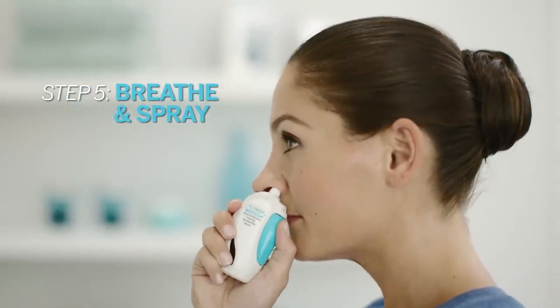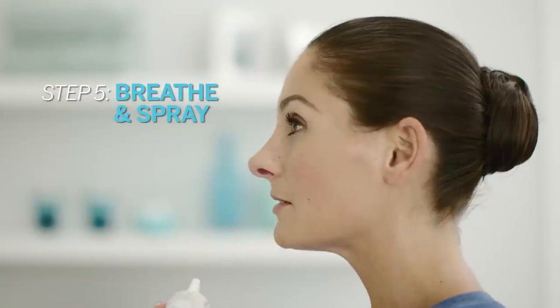While sniffing gently, press the button all the way in twice. You may feel a light mist in your nose. Breathe out through your mouth and repeat in the other nostril.